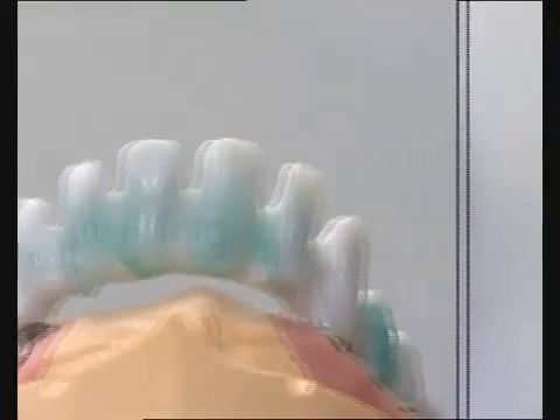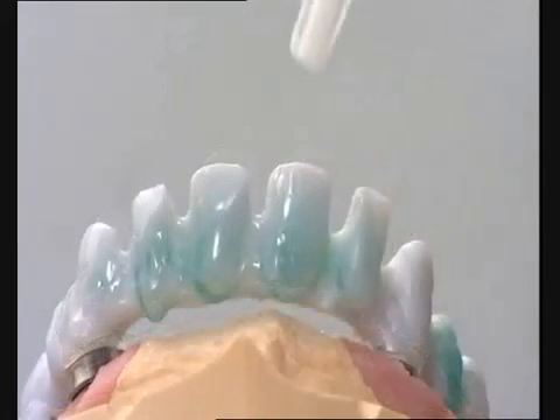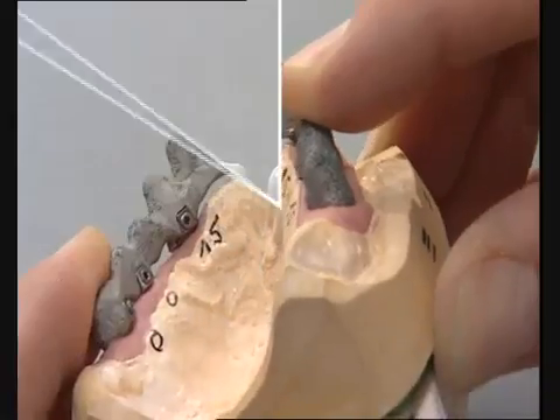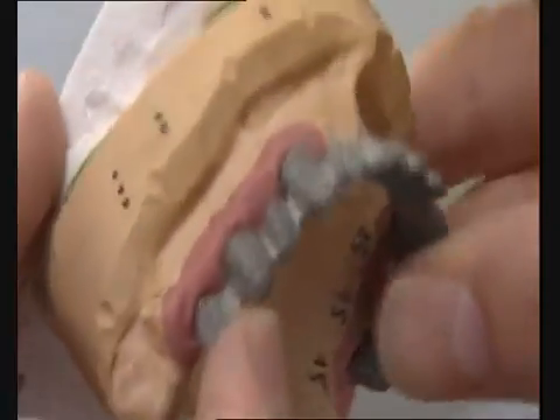Retention beads aid the acrylic-metal bond at a later stage. The framework was cast in a chromium cobalt alloy and finished.